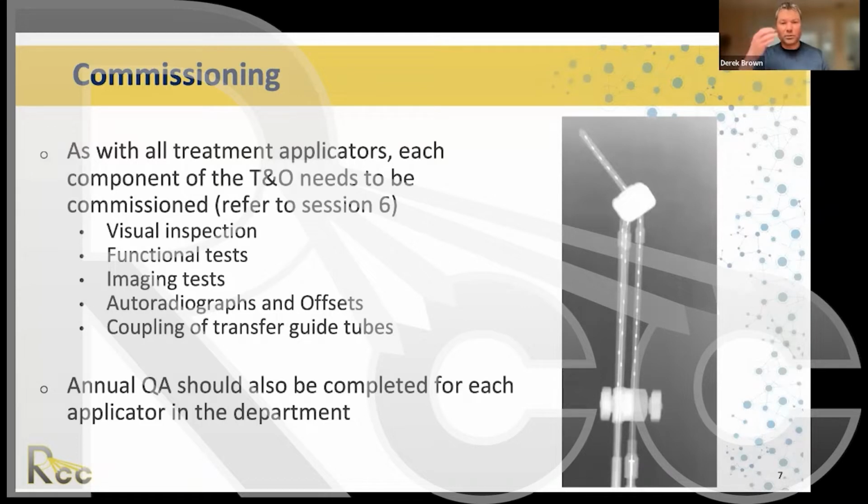It can't be. So we looked at the device and couldn't really figure out what was going on. Eventually we put enough force on it and noticed that one little cap at the end could actually slide forward. So it had started to pull off. So it's important to do these visual inspections and notice what's going on over the course of time as you're using these devices. The sterilization processes can be pretty tough on these devices, so always keep an eye out for that.